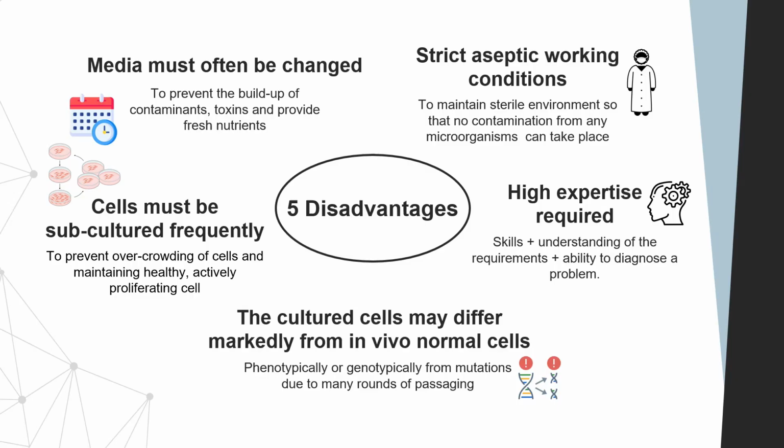Thirdly, high expertise. Successful in vitro cell culture requires a very high level of technical expertise and proficiency in aseptic techniques, cell handling, and culture maintenance. So you do have to possess a very deep understanding of cell biology, culture protocols, and must be very good at all your troubleshooting strategies in order for you to effectively grow and manipulate your cells in vitro. So you also need to know how to optimize your culture conditions for specific cell types. Okay, this may require a lot of very extensive experimentation and also optimization. So the skills are really advanced. You need really high expertise skills.